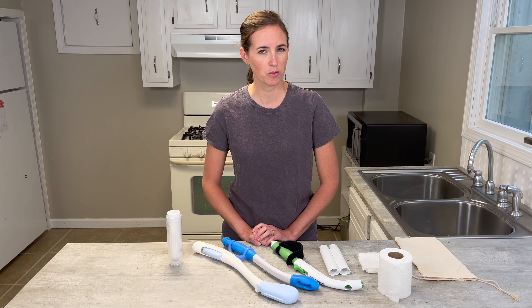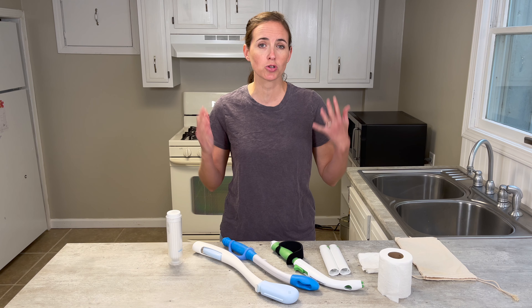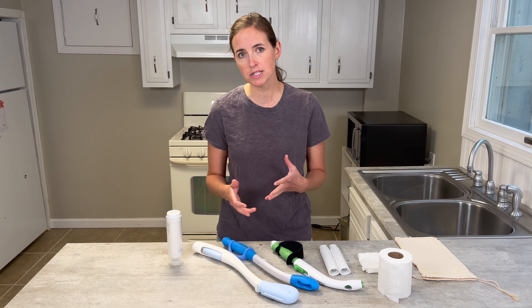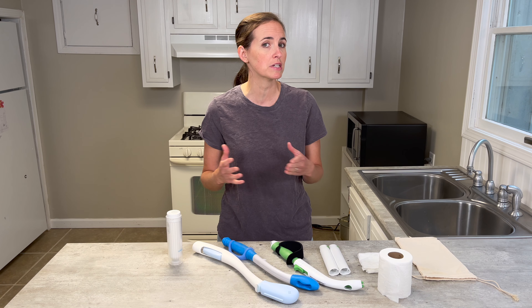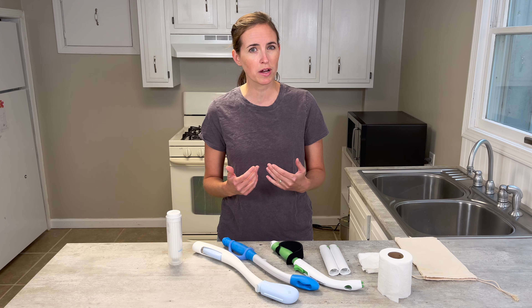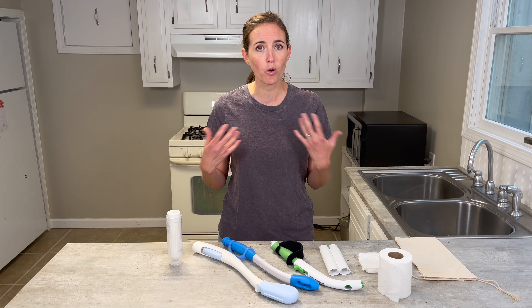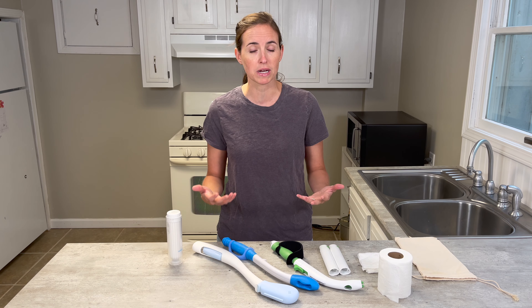Hi everyone, it's me, Lindsay, again with EquipMeOT, here today to talk about toileting aids. These come in a large variety, so what I wanted to do today was highlight several different types, who might choose which one, for what reason, and some of the design features you should know about when selecting one for yourself or somebody else.